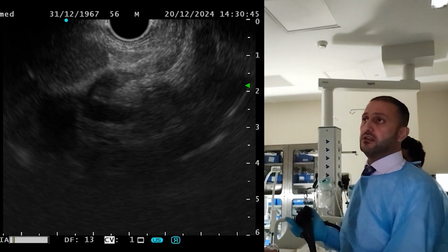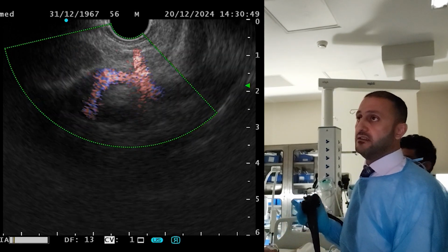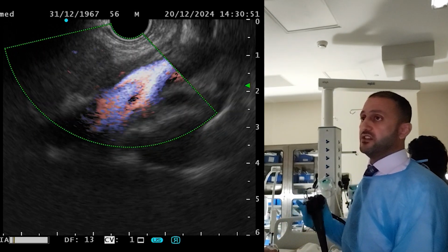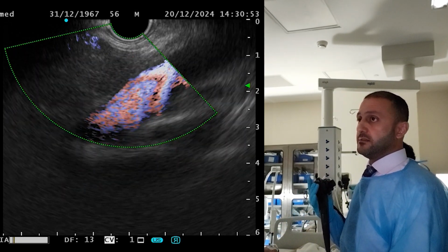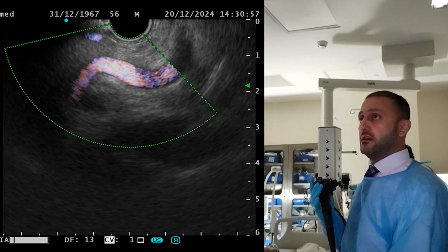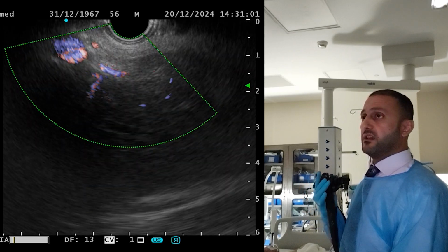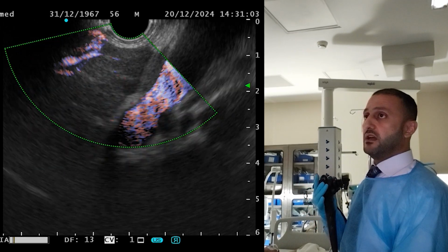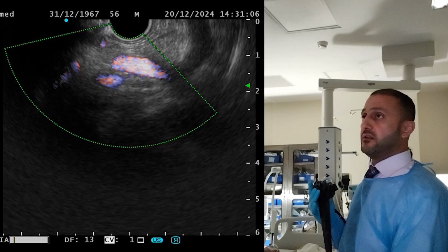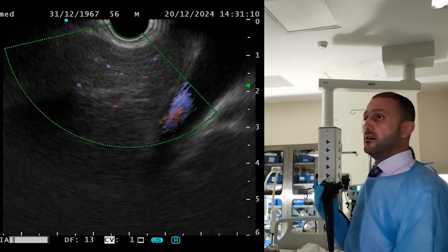internal organs. Porta hepatis means next to it the CBD, not dilated in this case, which means the patient is not having an obstructive jaundice. The confluence is clearly seen here. The portal vein is dividing into the anatomical confluence. I don't see any pathological lymph nodes even in the portal vein area.